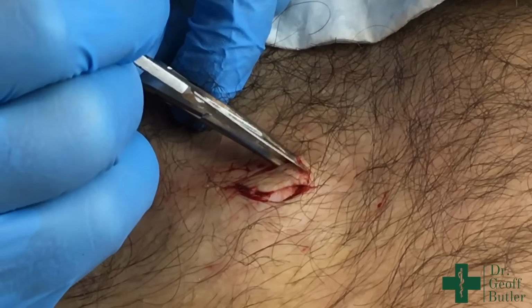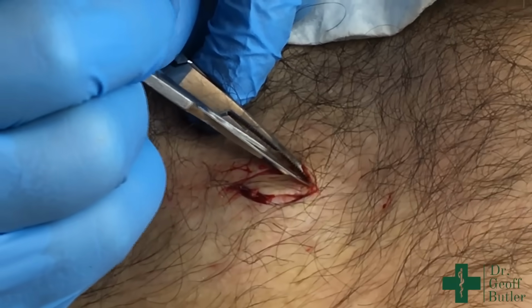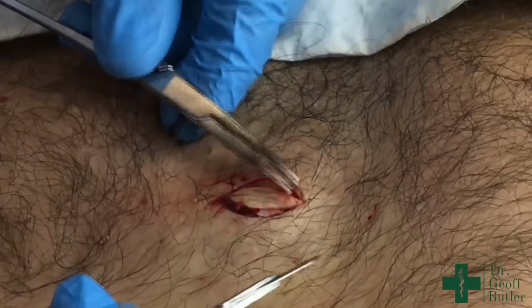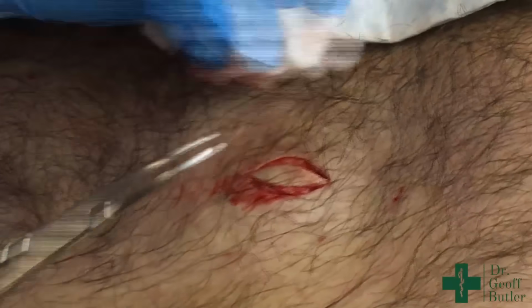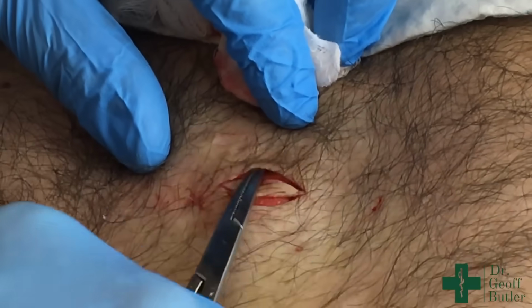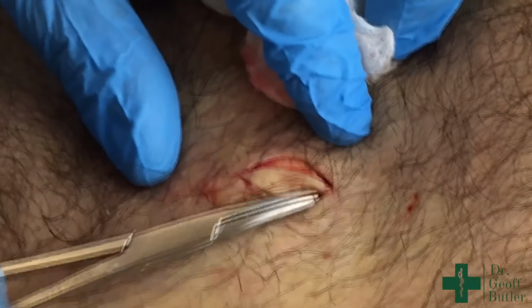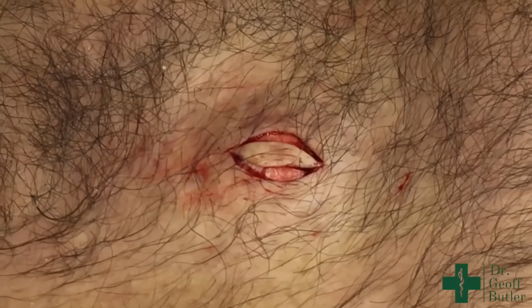This would certainly be more relevant, putting this underneath, if the capsule was not ruptured at all, but I still think it's relevant because we're just trying to maintain this as much as possible. And you're having no pain, Mike? No, not at all.